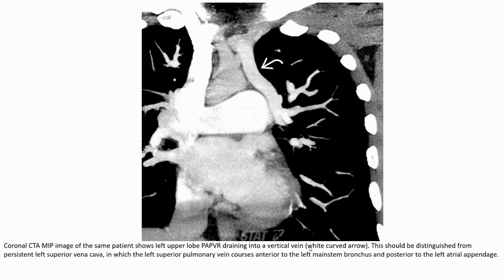Coronal MIP image of the patient shows left upper lobe PAPVR draining into the vertical vein. This should be distinguished from persistent left superior vena cava, in which the left superior pulmonary vein crosses anterior to the left main stem bronchus and posterior to the left atrial appendage.